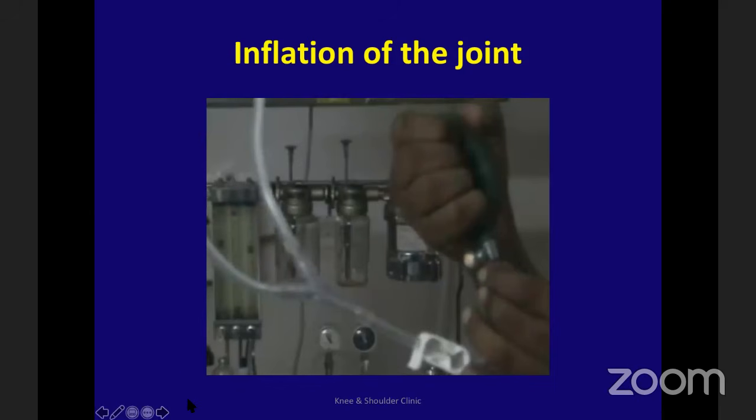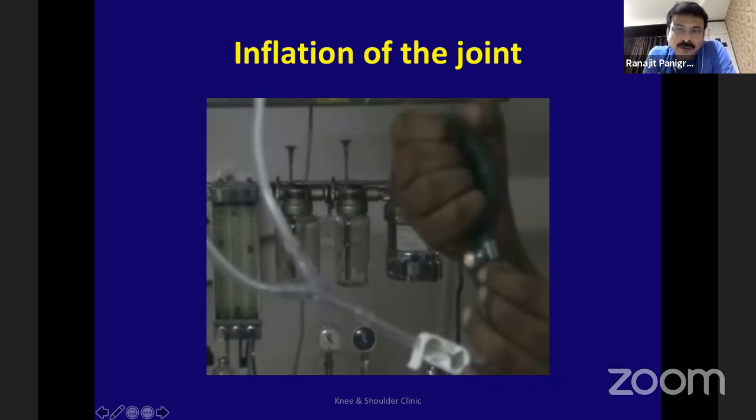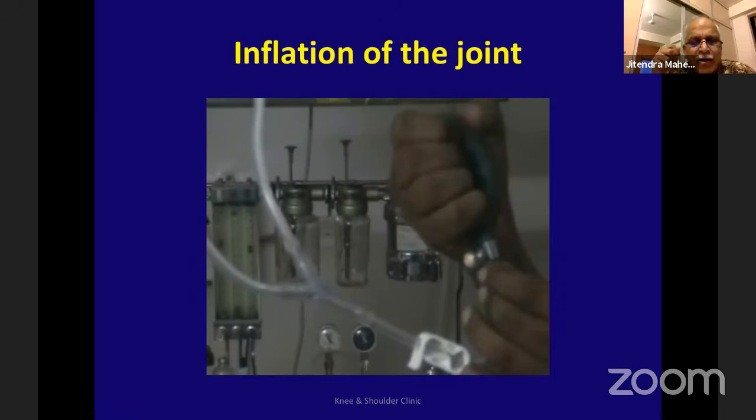Sir, in case there is reverse flow, will it compromise the sterility of your procedure? That is why, as sir said, you actually let 100 ml go first. There will be an air column above the bottle. The entry you are making in the tube on the top is unsterile. We try everything, but it's still unsterile. It should not touch the water. While putting the TUR set also, you have to apply some kind of sterilium over that part, and then you pierce. Yes, you're right. So there's a little bit of a compromise of sterility here even then.